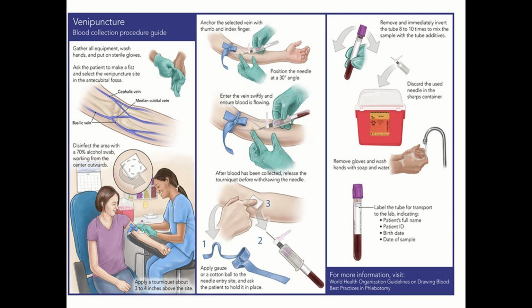So before we even begin collecting the sample, before we even begin drawing the blood, especially WHO has set certain guidelines for blood collection in patients who get diseases like Ebola or COVID-19 type diseases. Whenever there is an epidemic or a pandemic, they have stricter guidelines for venipuncture.